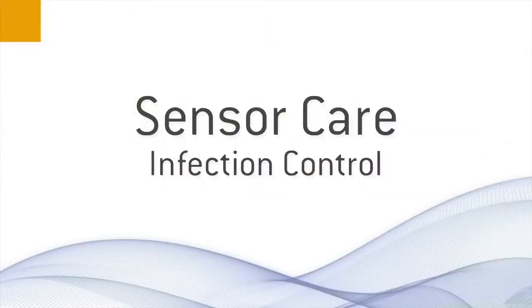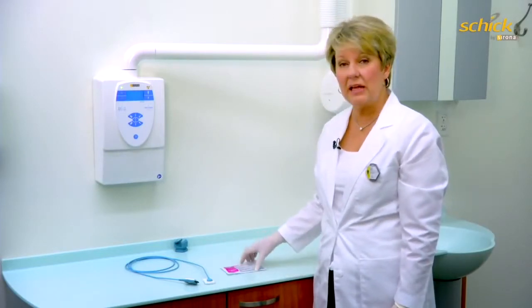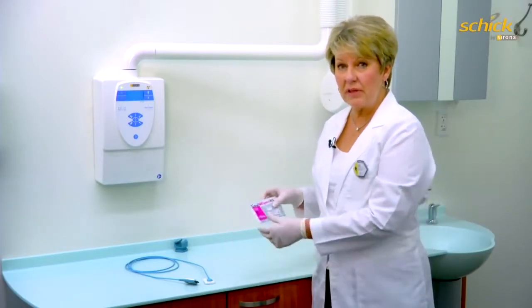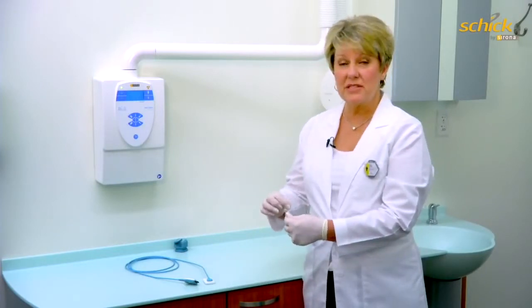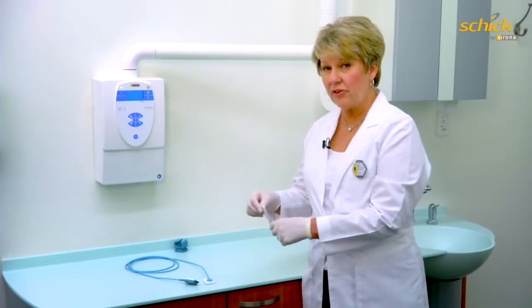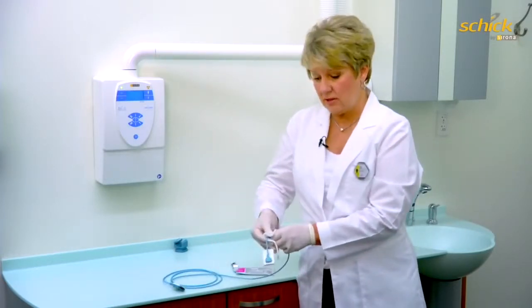Using proper disinfectant techniques with our sensors is very important. We want to make sure that you're using a recommended cleaning product such as Cavi wipes, pre-moistened towelettes. I recommend following the cleaning directions on the back of the packets. But when wiping down your sensor and cable, make sure that you're wiping towards the sensor head or the sensor connection.